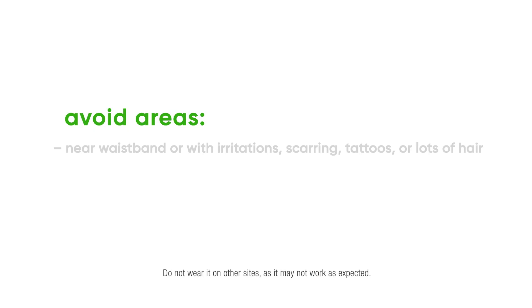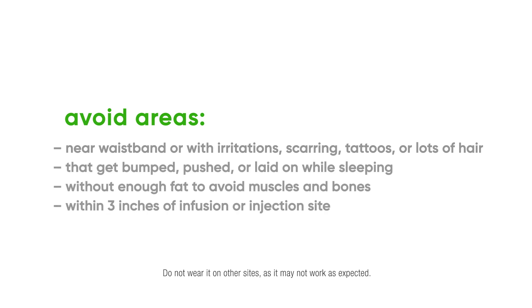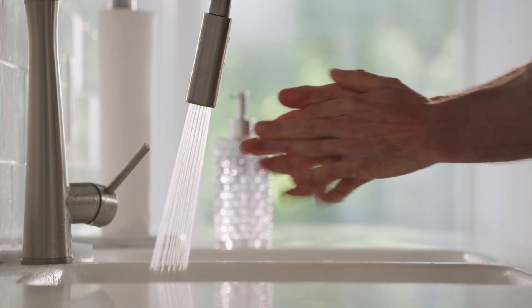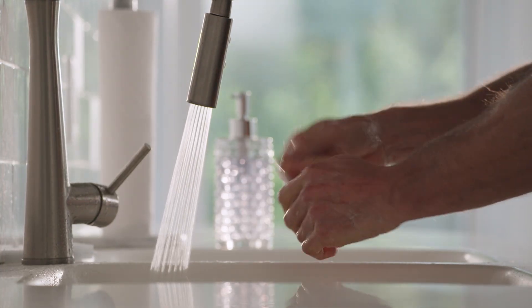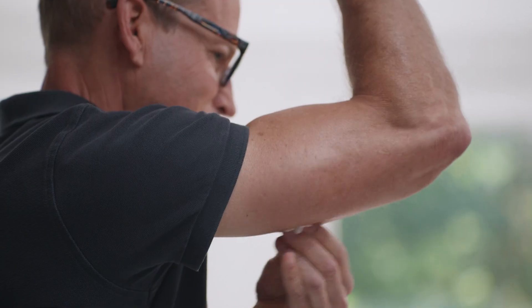Now let's insert the sensor and apply the overpatch. Follow the insertion instructions carefully. Extra care may help you keep your sensor on for the entire sensor session. Before you begin, wash and dry your hands. Then clean your site with an alcohol wipe and let it air dry for at least 10 seconds.